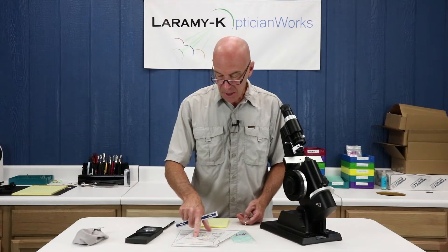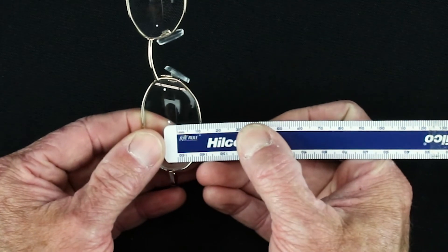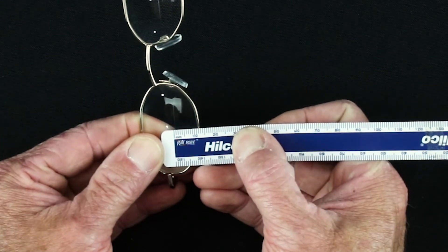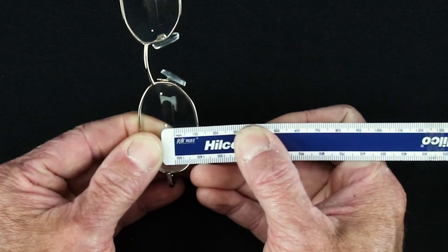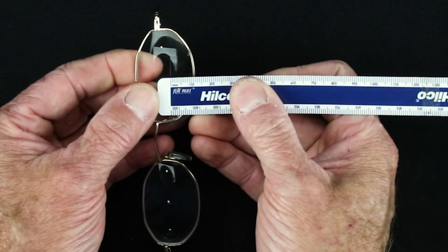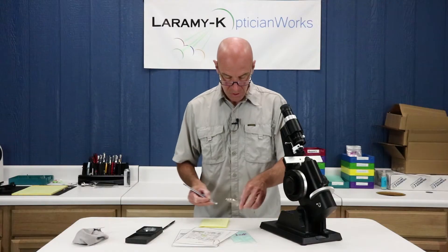The last thing I need to check is my height, which is supposed to be 12 in each eye. Heights are measured from the deepest point in the frame. I have got about 11.5 in each eye, which is perfect — no problems there.